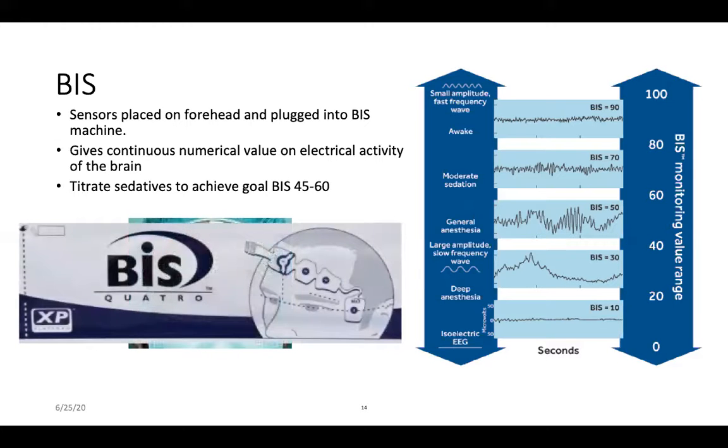You see here on the packaging, we have the arrow pointing directly down between the nose toward the top of the forehead. Then we have it going in a downward angle. We have number 4, which is actually the third one, directly over the eyebrow. And then we have the last probe on the temple, which is in line with the outer canthus of the eye.